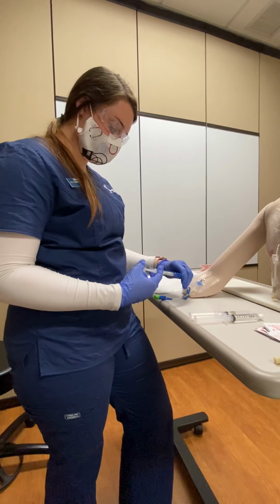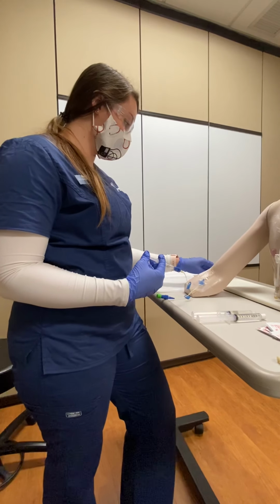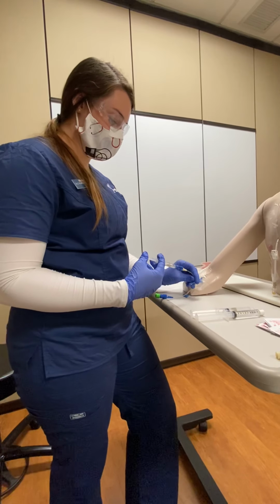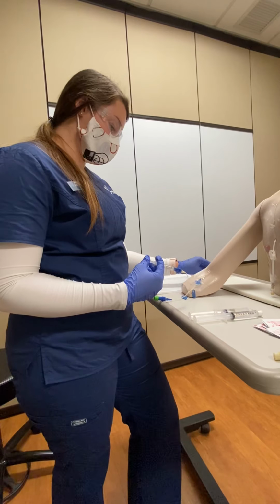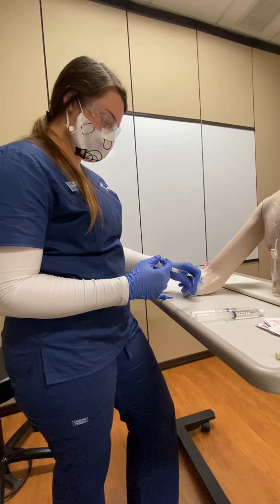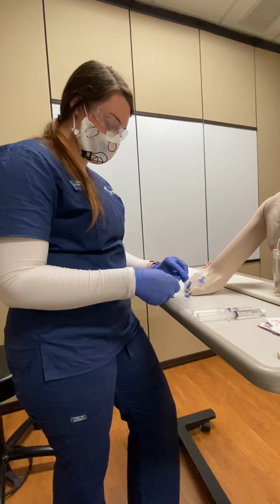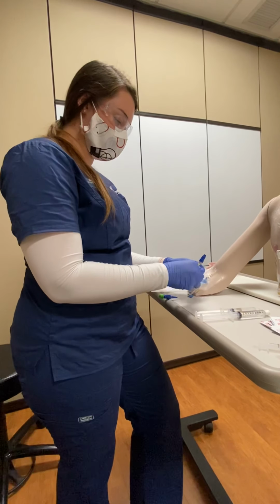Okay, 1.6 milliliters. I'm going to give it over 2 to 5 minutes, but I'm going to have to undo the clamp first. All right. Over 2 to 5 minutes, but in this case, I'm just going to give it all. I'm going to re-clamp. Still observing for any adverse reactions, and we will be monitoring her.